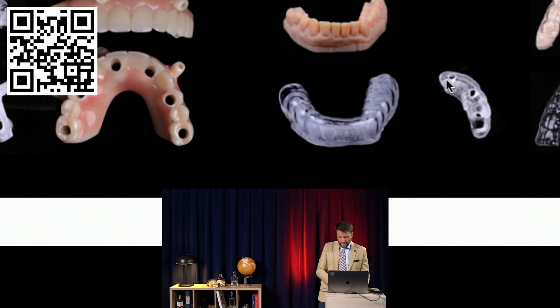Now, this guide fits into the lower teeth without composite. That's why the cases that we send to our doctors, they have a script so the doctor doesn't get lost on the sequence, because if you mess up the sequence, things don't fit. So what is step number 1? Place the lower single implant. Why? Because the guide fits the natural dentition before the composite.